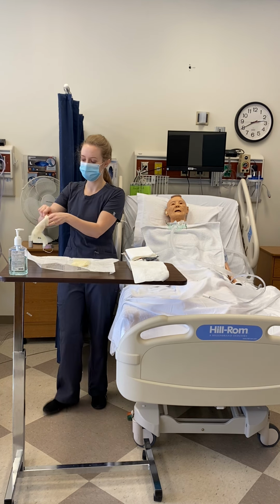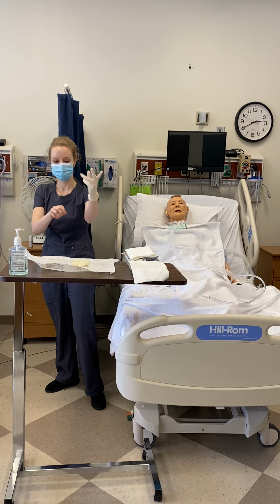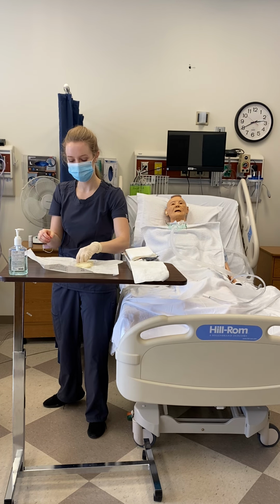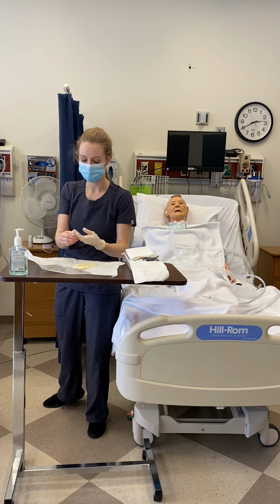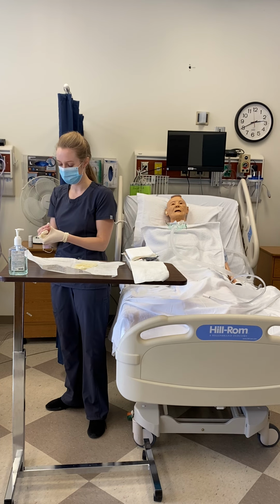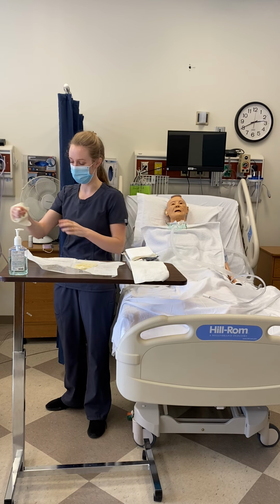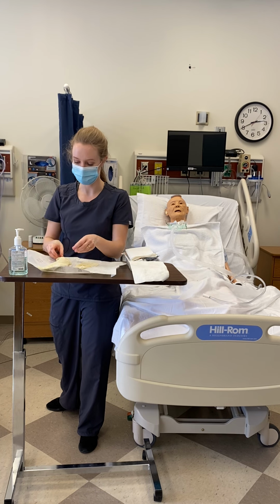And I'm going to make sure my cuffs don't roll, don't break sterility here. My cuff is a little rolled there. Oh, I would not normally do this, but it appears my gloves have been open. I just put it on the wrong hand. Apologies. So sorry, starting over.